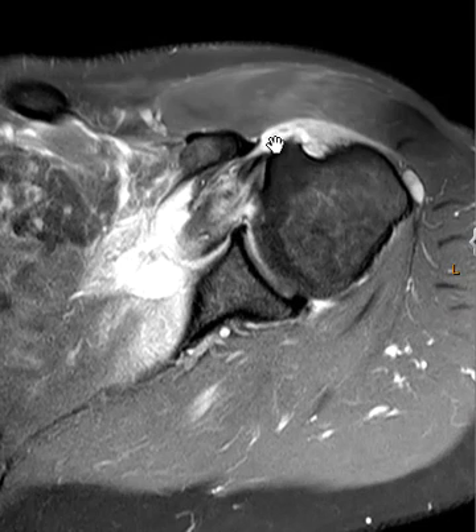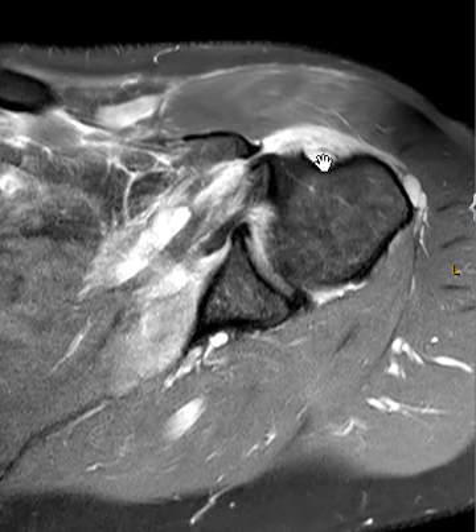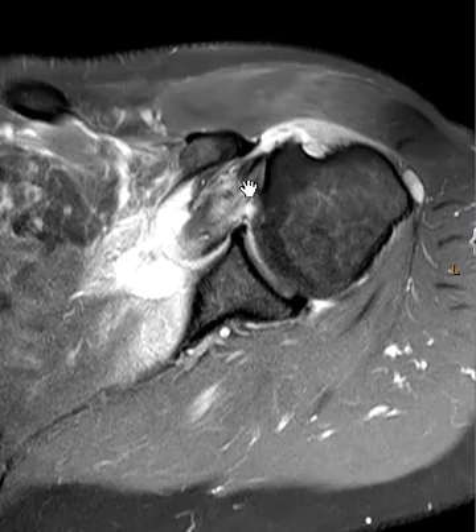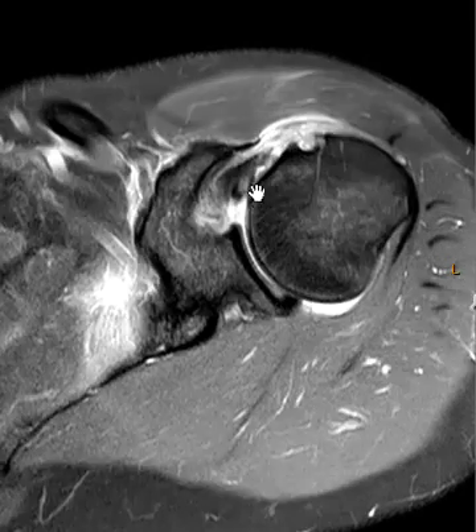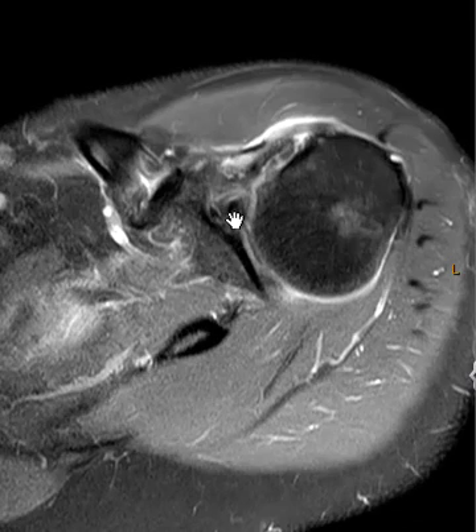The subscapularis tendon, while attached at the lesser tuberosity, has fibers that go over the top of the bicipital groove holding the biceps tendon in place — this is called the transverse ligament component. When that transverse ligament is torn, the biceps tendon can dislocate medially, as in this patient, and the subscapularis tendon is yanked out of the way so the biceps tendon goes right where the subscapularis tendon should be.